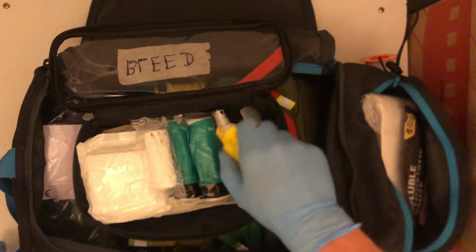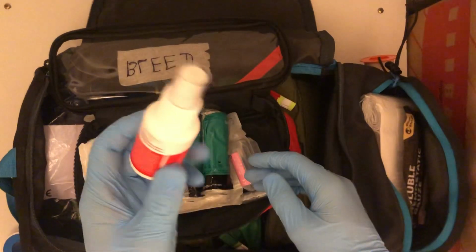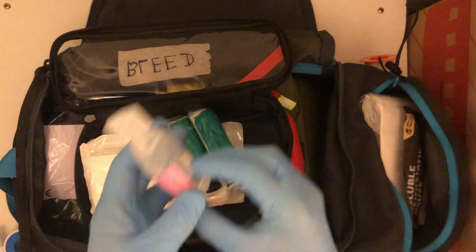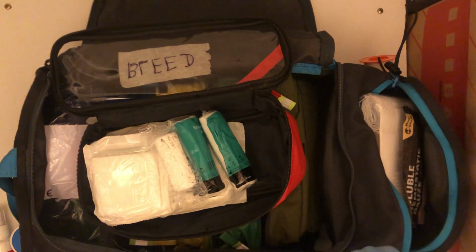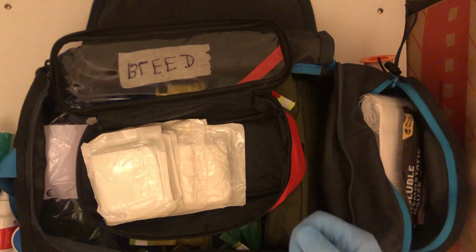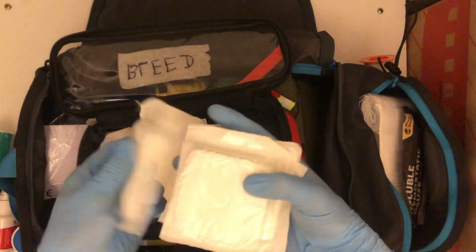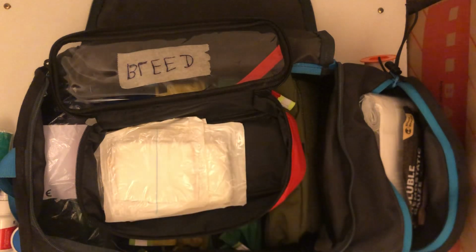Roll of tape, betadine. In case anyone's allergic to betadine, I got a second disinfectant here. A dose of normal saline for irrigation. Roll of duct tape, you never know, to improvise chest seals, basically. Then I got rolled gauze to do wound packing in case the hemostatic agent fails, or to wrap basic wounds. I got a whole lot of gauze. Each of these packets contains 5 gauze pads, so there I got 25 gauze pads.